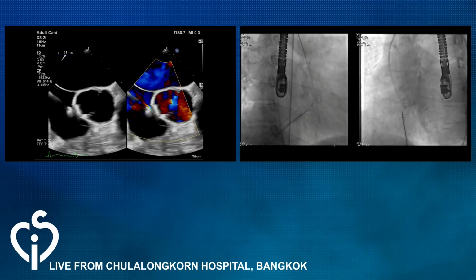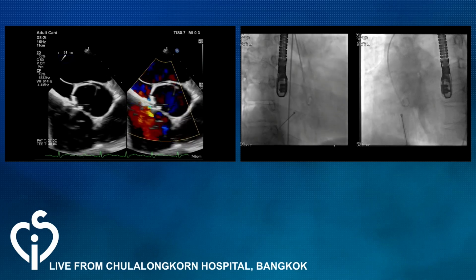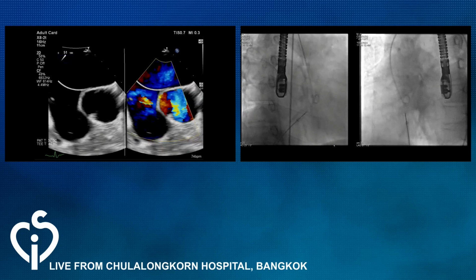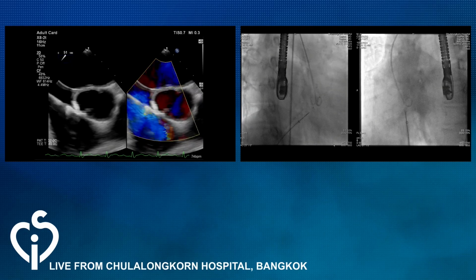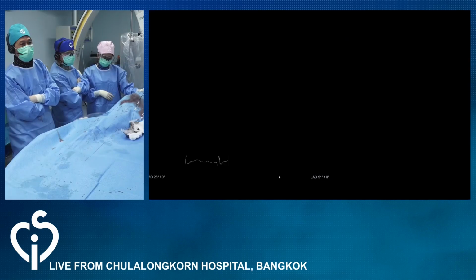But I think on transesophageal, the position looks great. Yeah. I think we have just occluded the mouth of that aneurysm. Perfect position. I wouldn't reposition this device. Yeah. On the aortic end, it's nicely opposed, isn't it? So the rest of it has to be through the rupture.